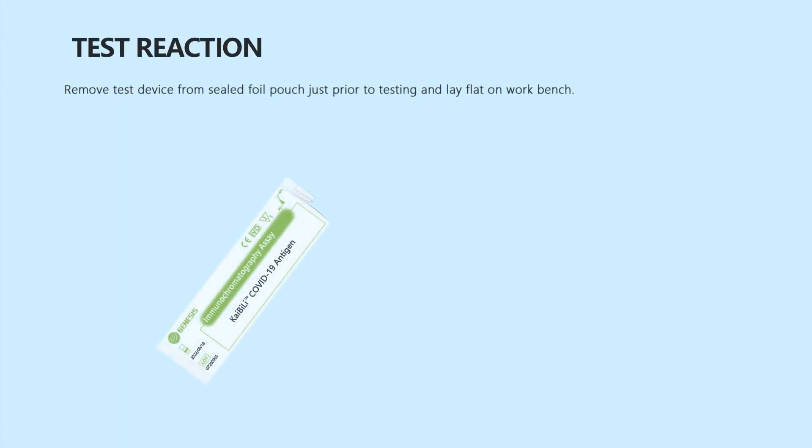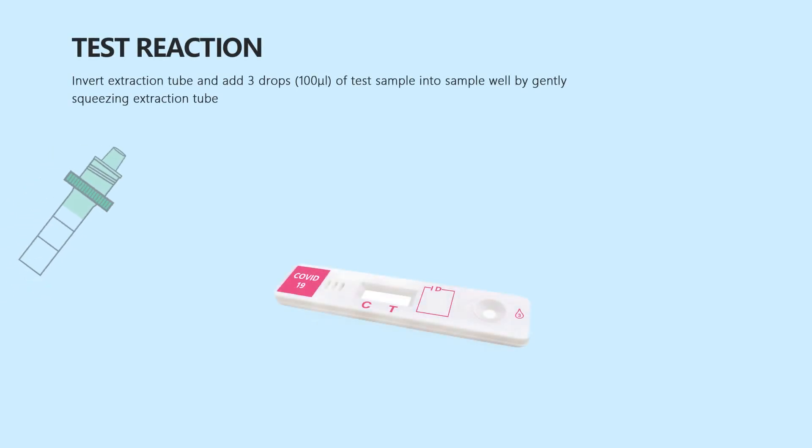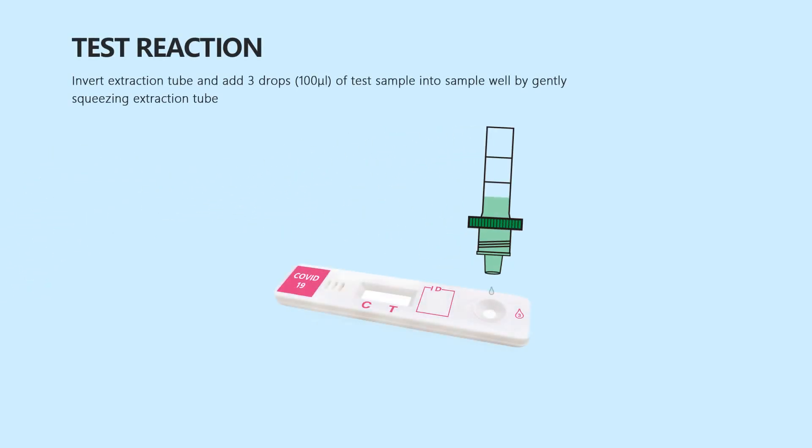Remove the test device from the sealed foil pouch just prior to testing and lay flat on the workbench. Insert the filtered nozzle into the extraction tube containing the test sample. Invert the extraction tube and add 3 drops of test sample into the sample well by gently squeezing the extraction tube.